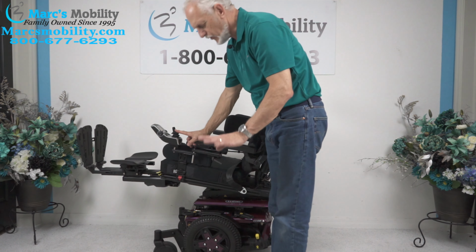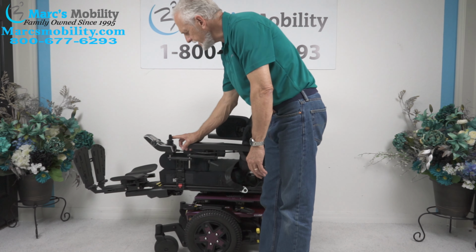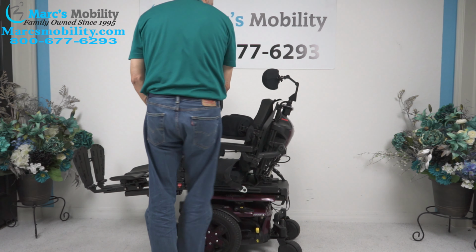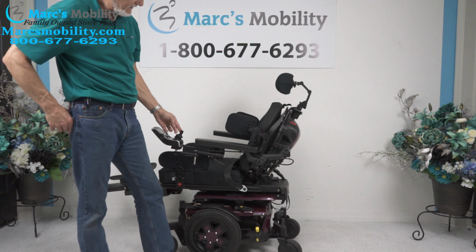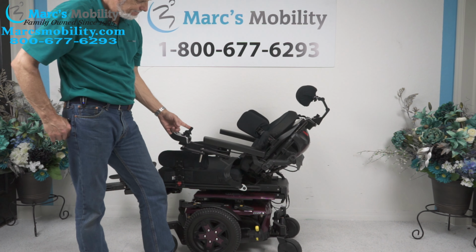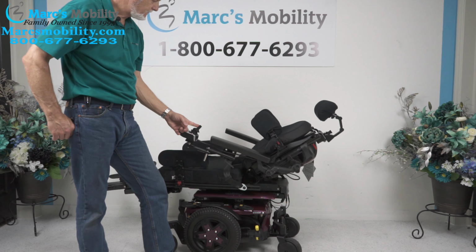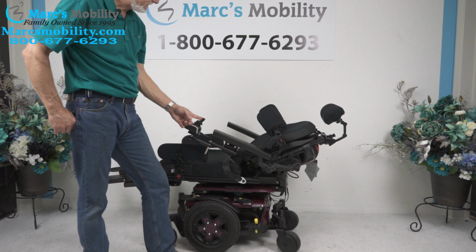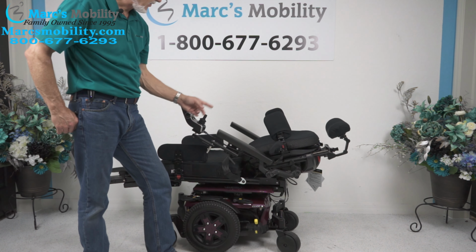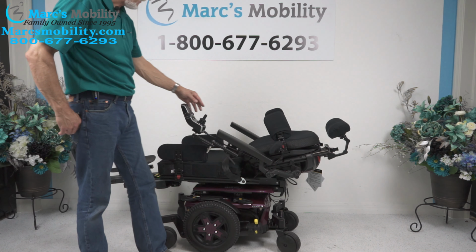So the last of the 4 functions is called the electrical recline. So the electrical recline is when the back goes back by itself. So you can see the back going back. That's called the electrical recline. So if you wanted to take a nap, you need to relieve some pressure, this would be a good way. So this is as far as it'll go. So this is the maximum positioning all the way down.